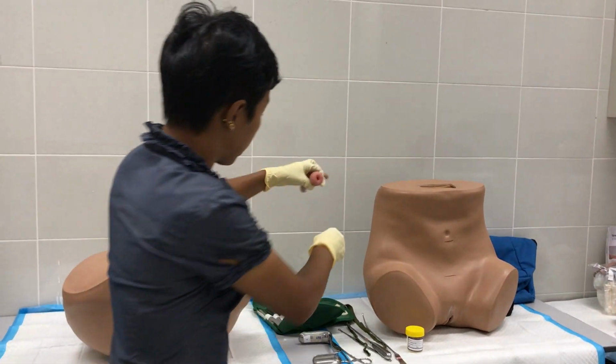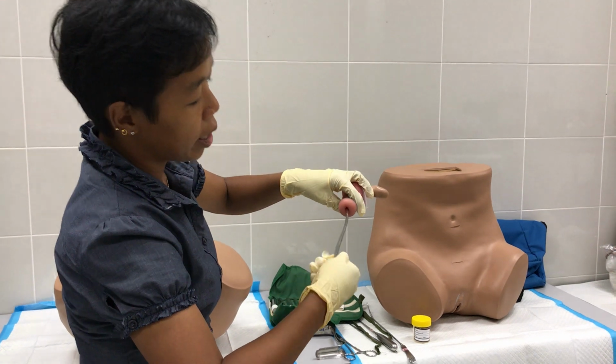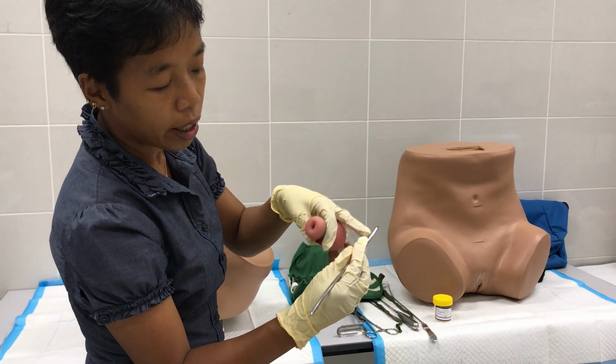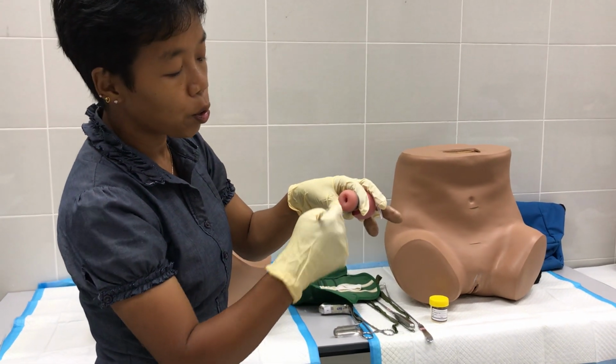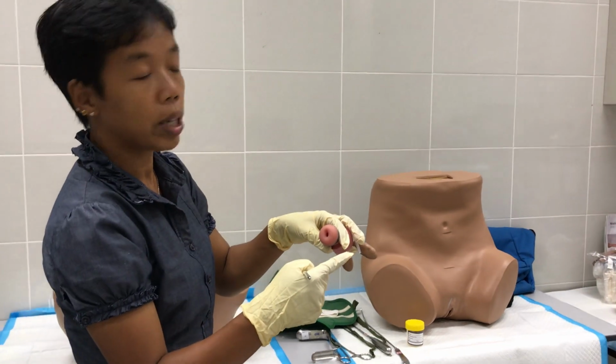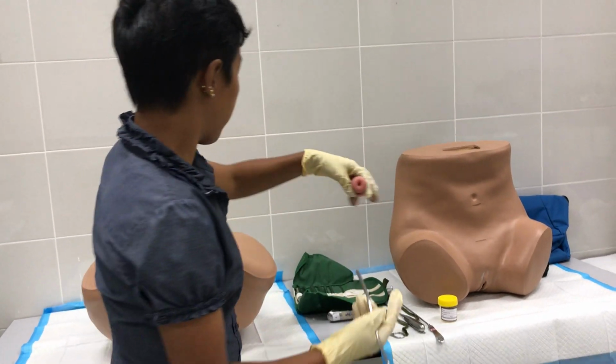You put the dilator inside the os and dilate it, normally 5 to 6. After that you can introduce the hysteroscope, because the camera diameter is around 5 mm, which is enough for the hysteroscope.